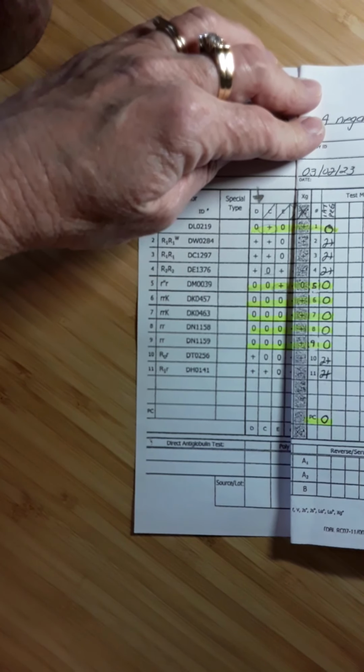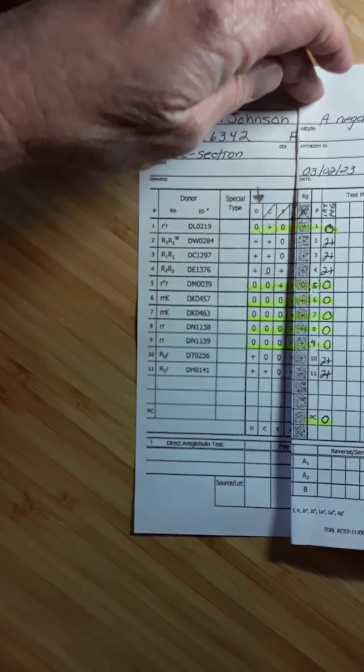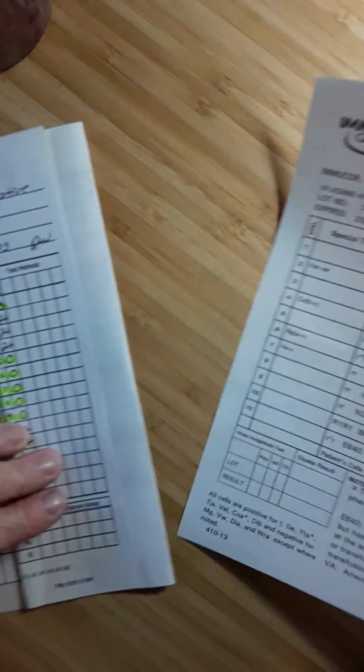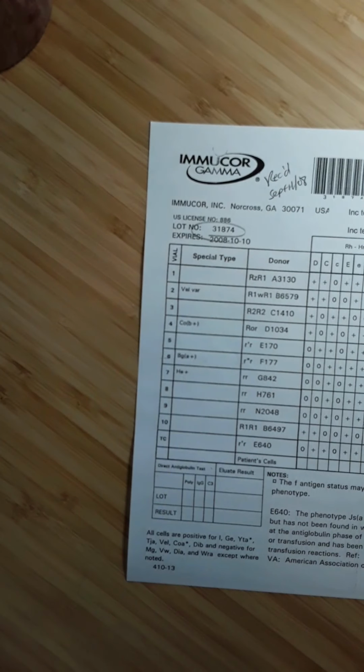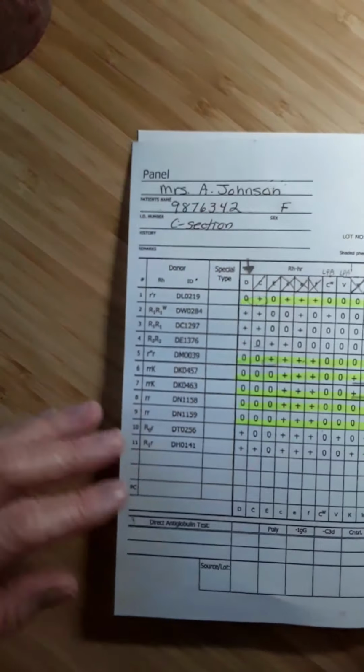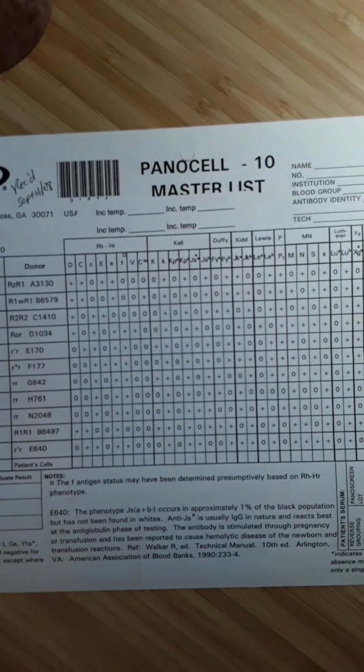So you can go and find in your lab, hopefully there is a different panel that you guys purchase. So for example, here's panel 31874. The panel that we originally had on Mrs. Johnson was 1225. Looking at this panel, is there a cell on here that would help us determine that the patient's plasma contains only an anti-D and not an anti-big C or an anti-big E?